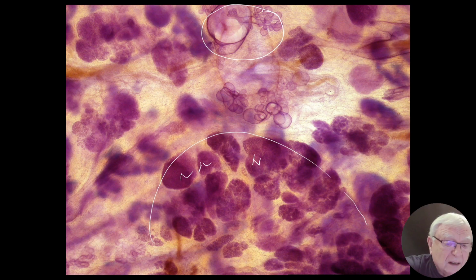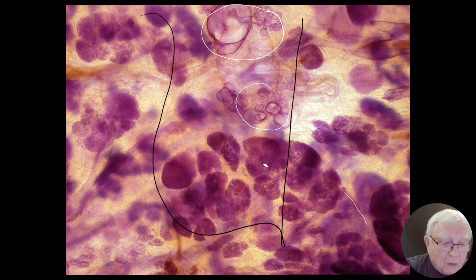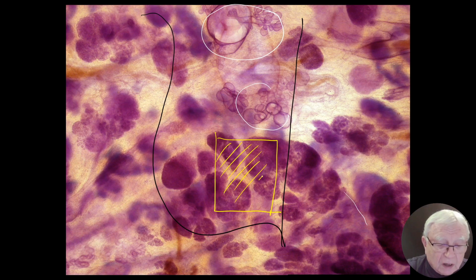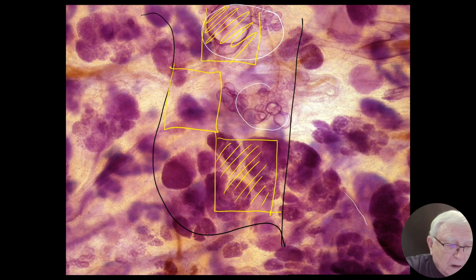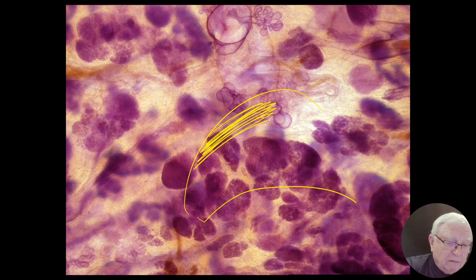Here, there is duct ectasia and microcysts. Can you imagine that the technologists have taken a picture of this? And please respect your poor radiologist. It's difficult to read a mammogram because we are imaging pathology, and a picture under this square inch is different from the picture under this, and it's very different from this. That's why it's so difficult to read a mammogram, because of the heterogeneous nature. I mean, just imagine what a liver looks like. Very homogeneous. Here and there and there and there is the same.